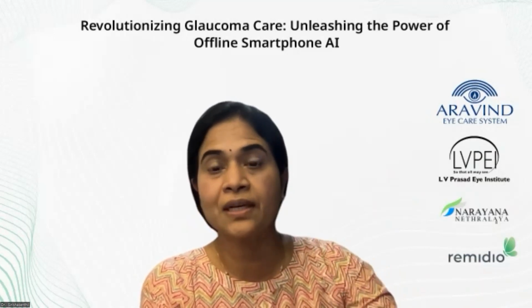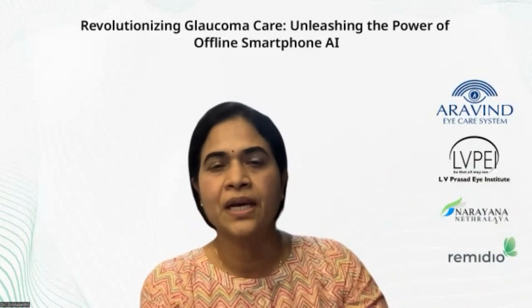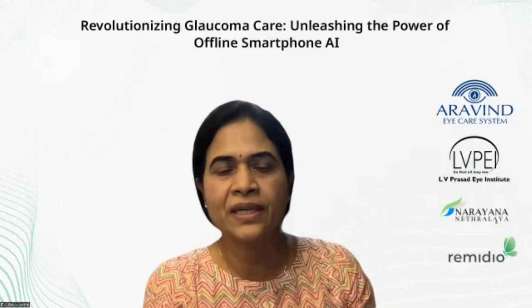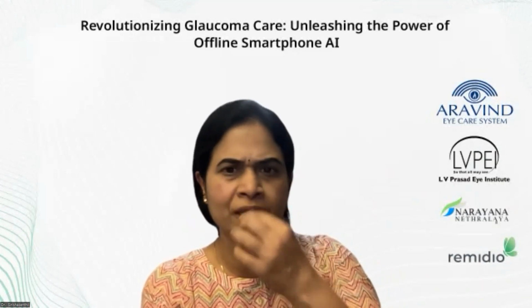And also, this is a non-mydriatic camera. So if you are so busy, the patient is busy, you are busy, they are not willing to wait, all you have to do is click a photograph. And I can tell you from the experience for children, they're quite comfortable.